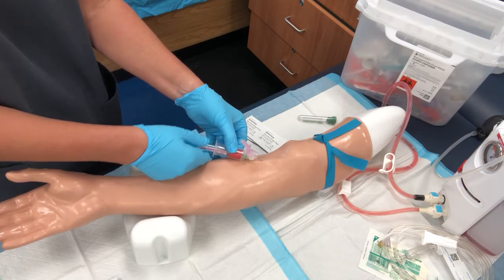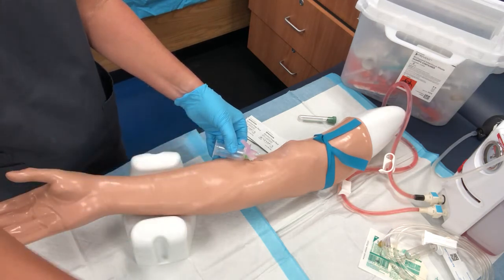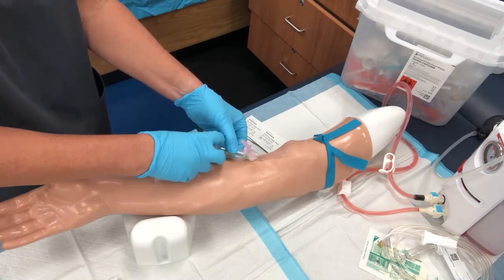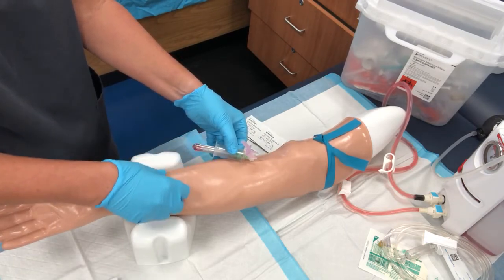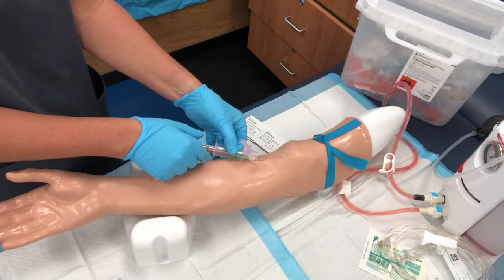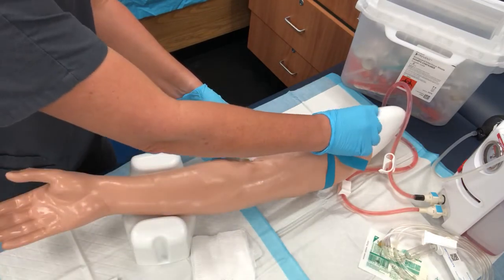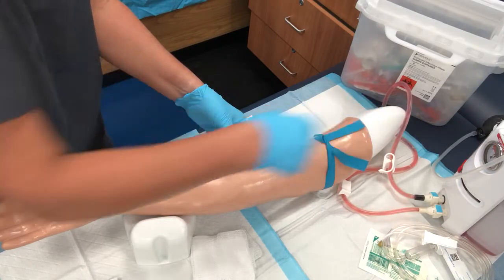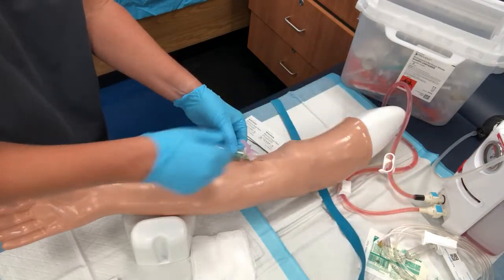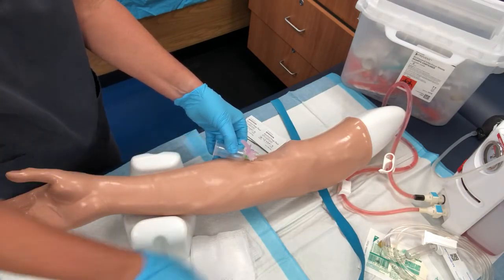So if in theory this filled all the way, I'd take this out, mix it a couple times, set it down. Maybe with readjustment I did a better job with the second one. I did. We're filling up. I've got my gauze. I'm gonna pop my tourniquet. Now this is where it's important, because as that last tube is filling, you can just pop your tourniquet off. That way you know you released it. Take your tube out. Go ahead and mix it a couple of times.